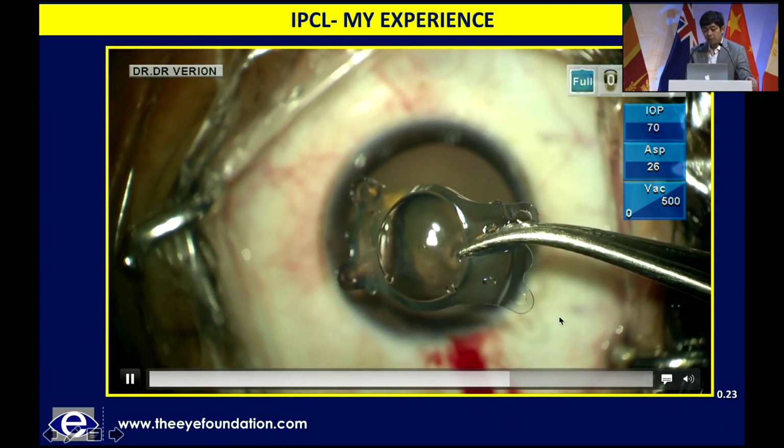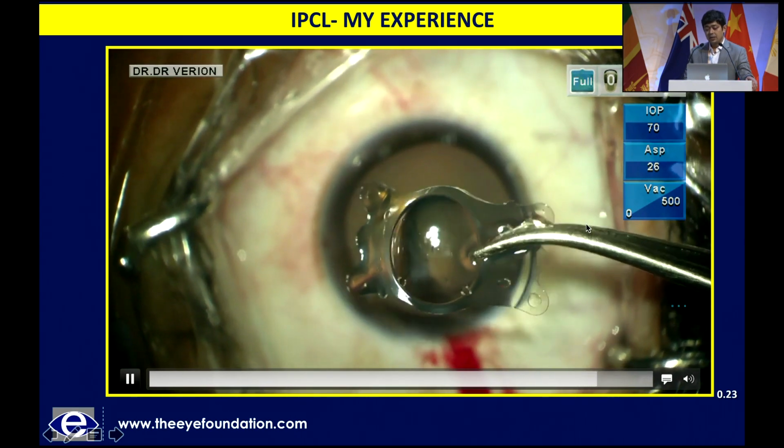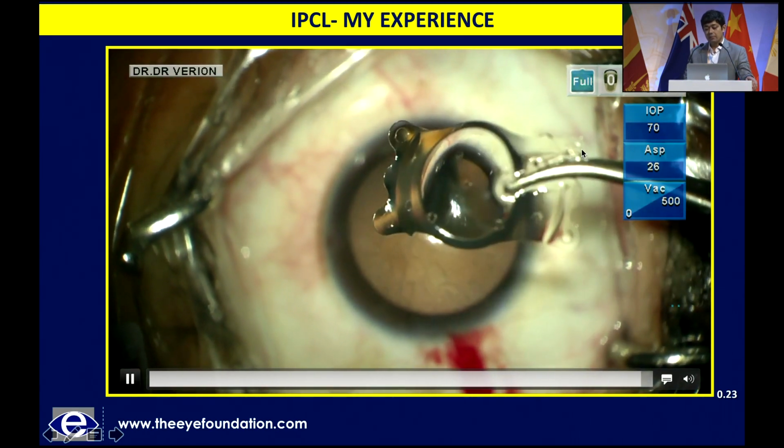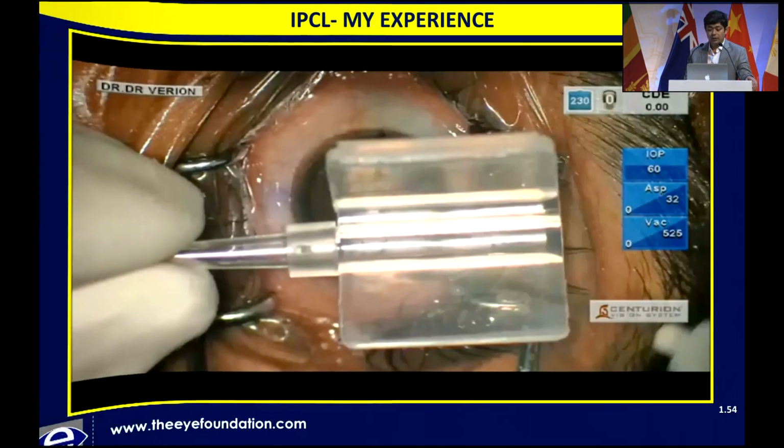Again, if the lens is completely flipped, that is in the reverse direction, you will still have the hole superior, but as long as the knobs are pointing in the leading left and trailing right, that's really the important point that you need to be seeing.